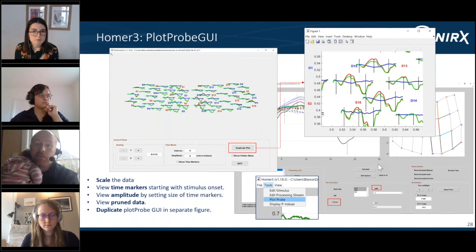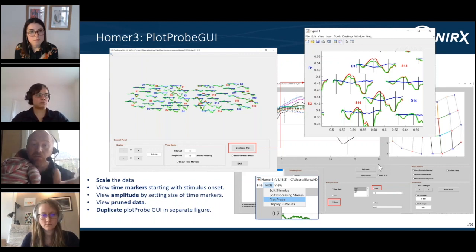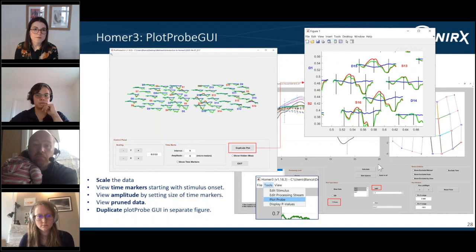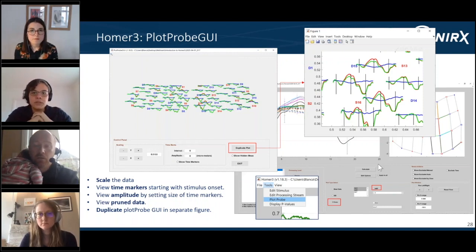My best guess would be that it actually includes the chunk of time that you've removed even when it computes the whitening, but then when it goes and solves the GLM, it takes it out. So it's not the best approach, but it avoids that issue of discontinuities. I can look at that and provide more detail because I'm not entirely sure how it's done in Homer3.